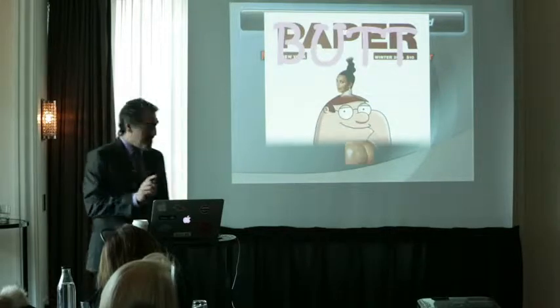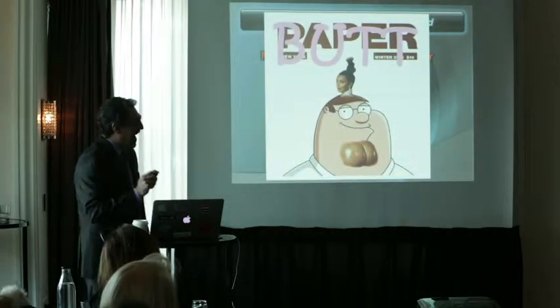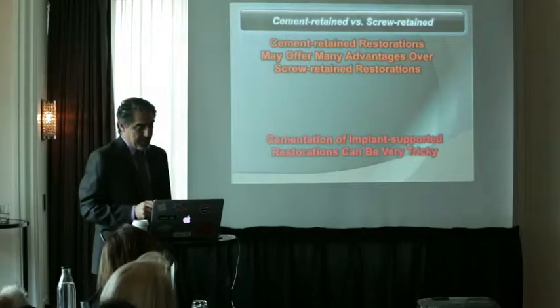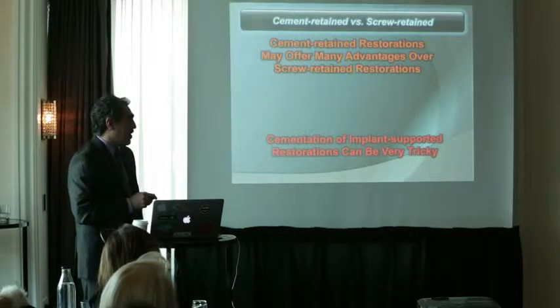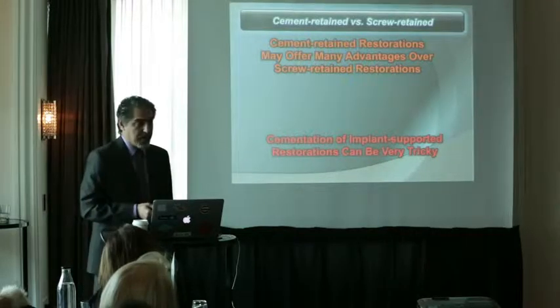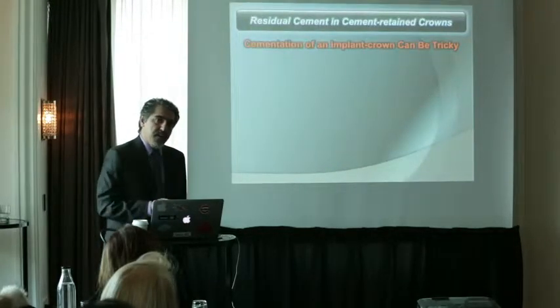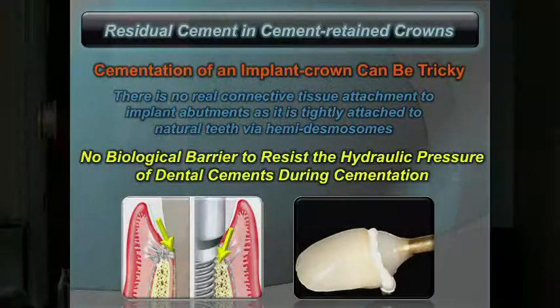You have to remember that there's a big disadvantage here. Cementation of an implant-supported restoration can be very tricky, very tricky. Even the most experienced clinicians can have a complication with that.